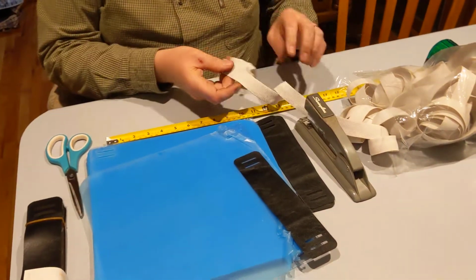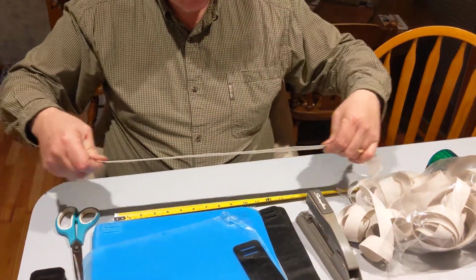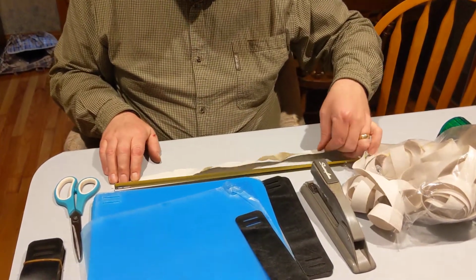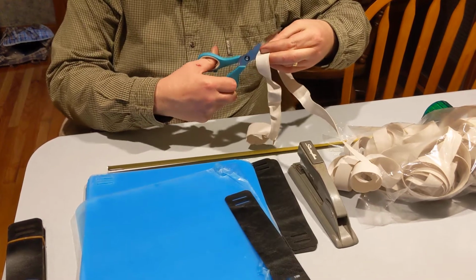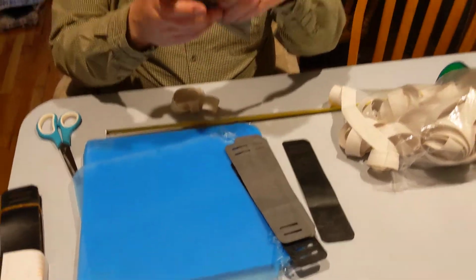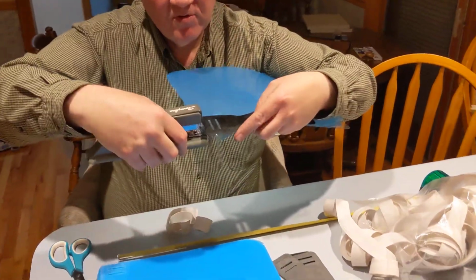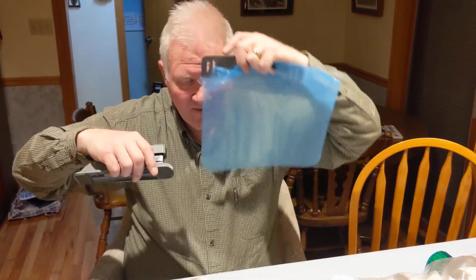For each one, you could prepare in advance pieces of elastic at its non-stretched length. Don't stretch it before you cut it, but at its collapsed size, measure pieces that are 16 inches in length for a normal size up to a large size, and then you can cut it at that point. Then to assemble it, you just use a regular desktop stapler, and when you staple it, you'll want to put the smooth part of the staple where it will bear against your forehead, so that the folded over corners are facing away from the person's head.